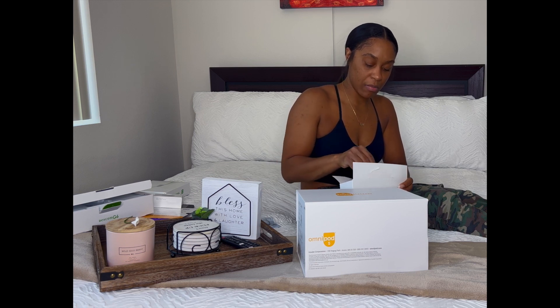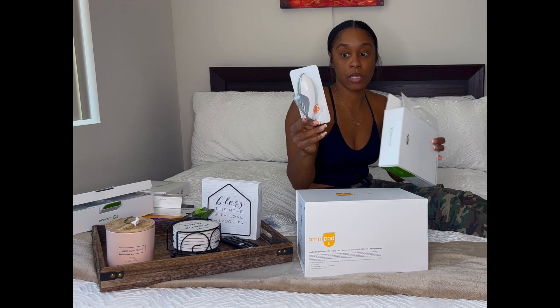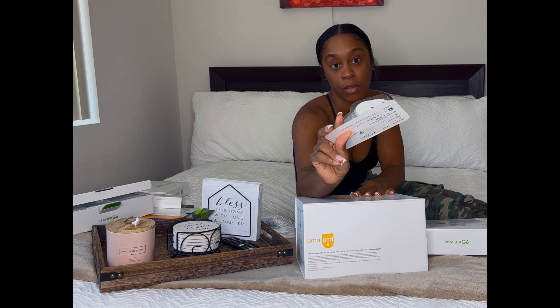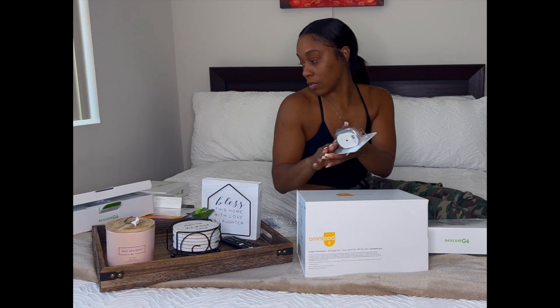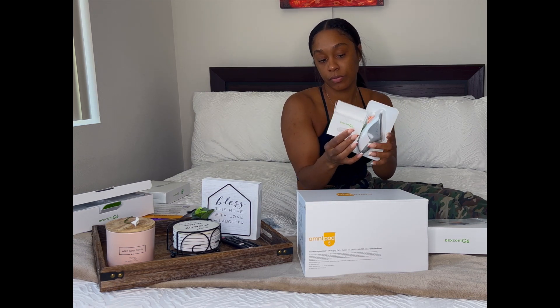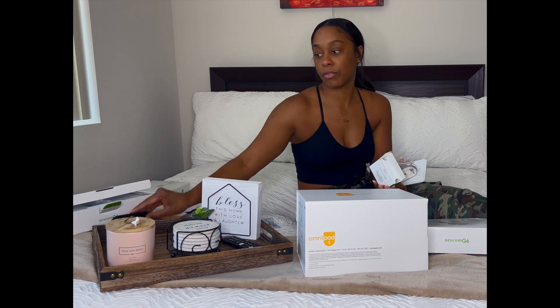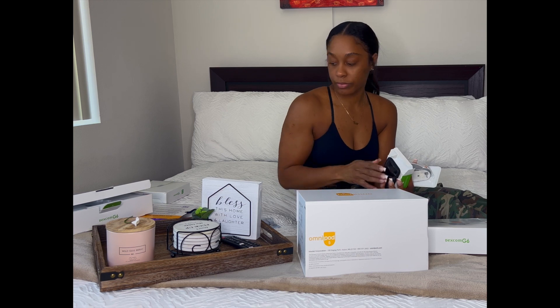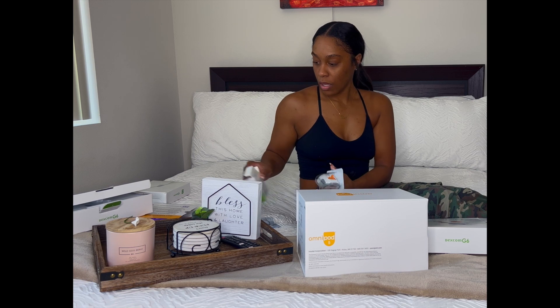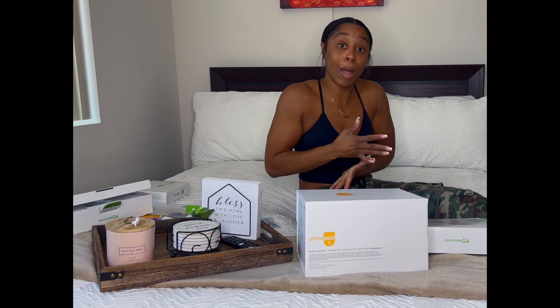I only have three sensors — this is technically a 30-day supply. You'll get a closer look when I apply them, but together you need the sensor, the transmitter, and — if you don't have an insulin pump — the receiver, then you just take your regular insulin as usual. I'm actually going to be putting them on my body today, so stay tuned.